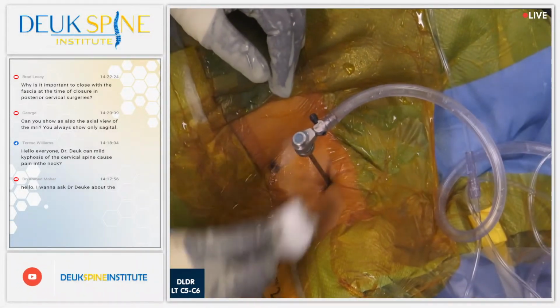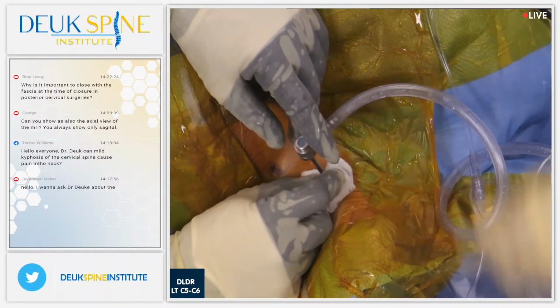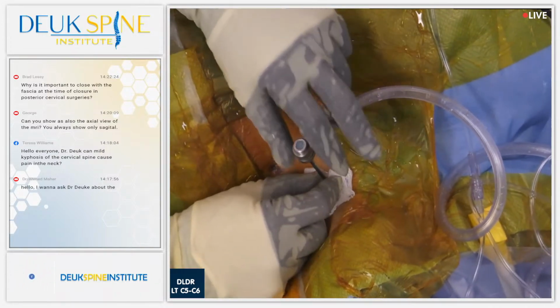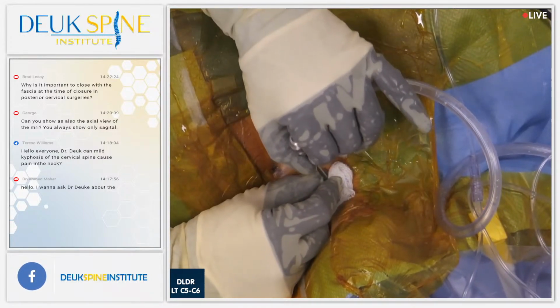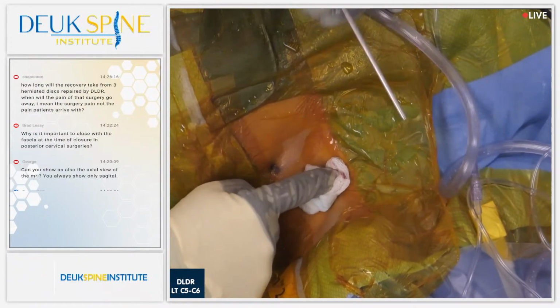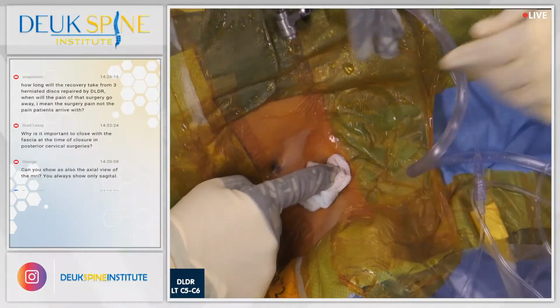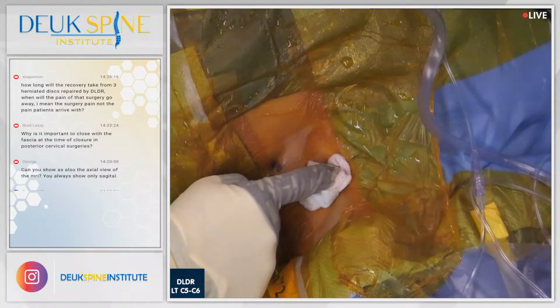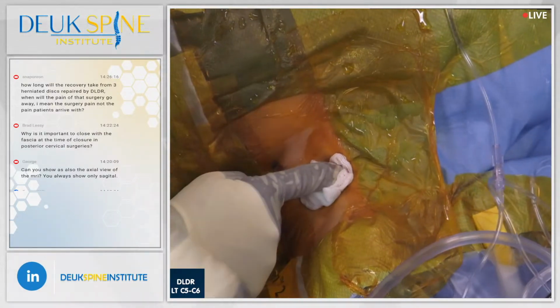And I used it for 20 years in my residency training, and surgeons used it even before that. Bacitracin, polymyxin in their irrigation. Now I just use a little bit of Betadine at the end. Here you go. Yeah, highly diluted. Yeah, do not use full strength Betadine. It'd be very bad.